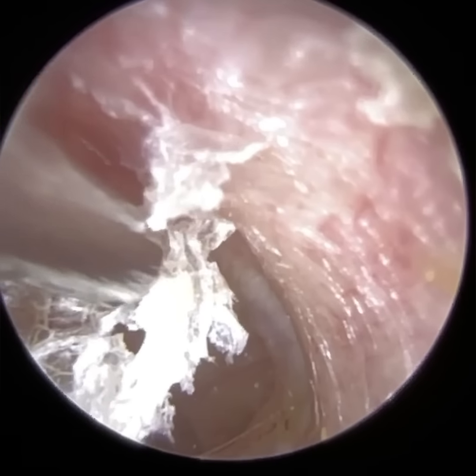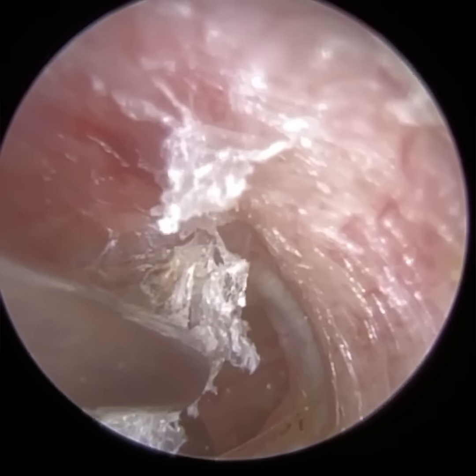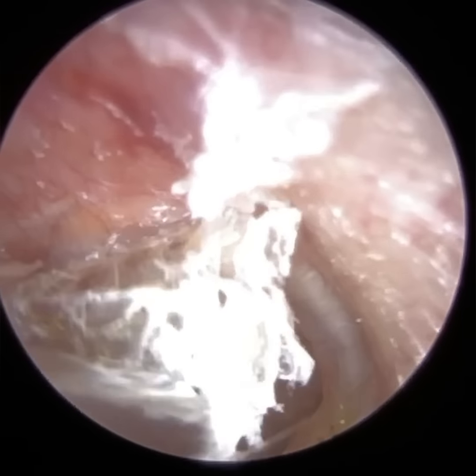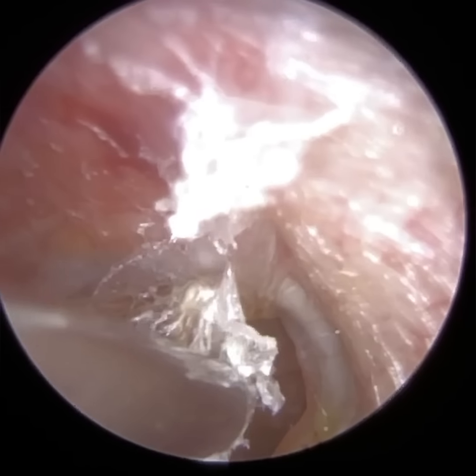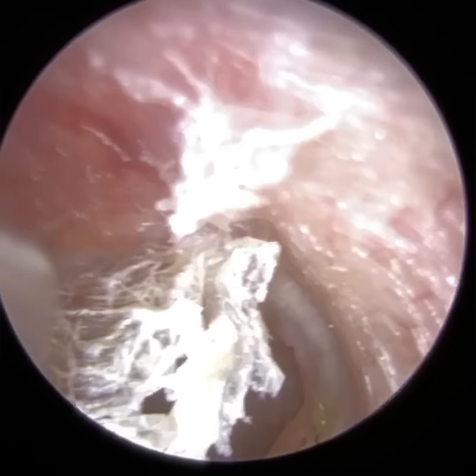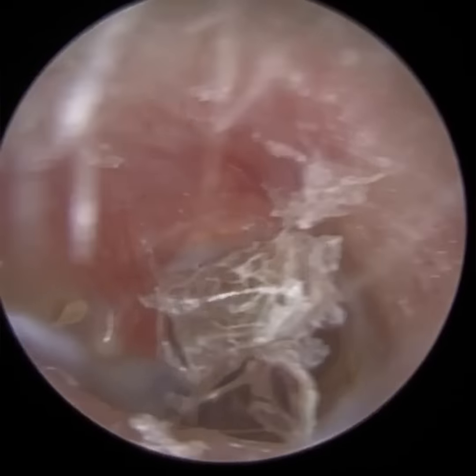So when sound hits the eardrum, because the eardrum is connected to the hammer bone, the malleus bone, it sets the hammer bone in motion. Those vibrations are then transferred through the remaining ossicles, the remaining bones, the incus and the stapes. And then the stapes moves backwards and forwards, but it's connected to the oval window. Now, beyond the oval window, the cochlea, I think that's where the patient found it slightly uncomfortable. You can just see the sort of movement there.